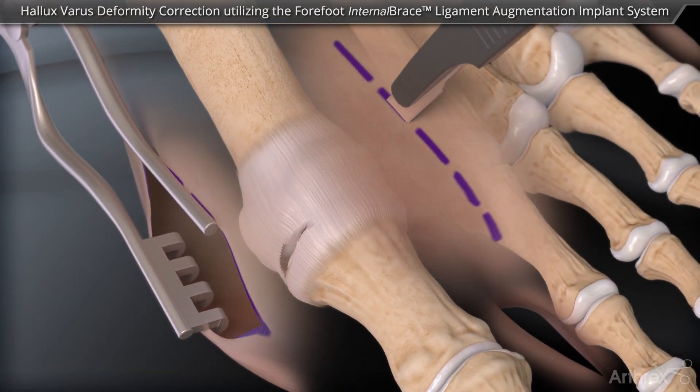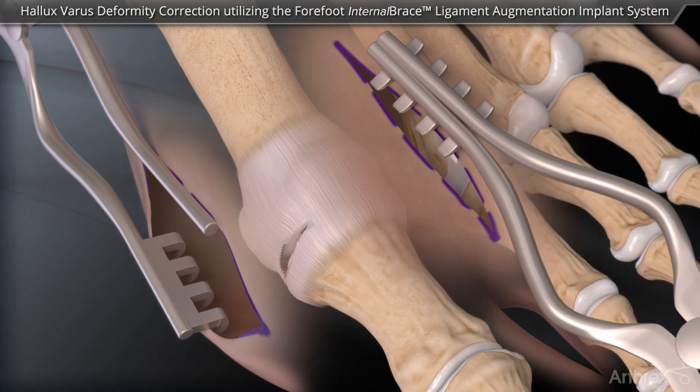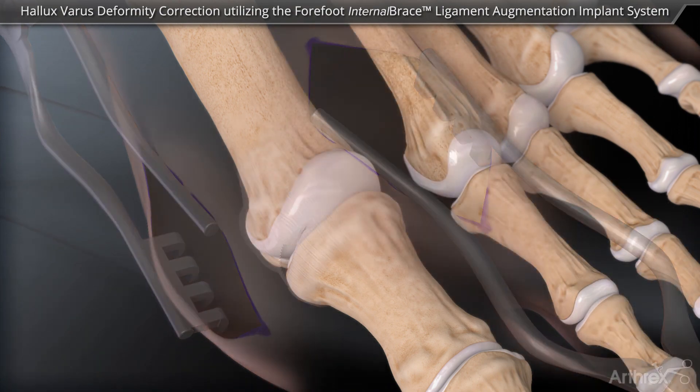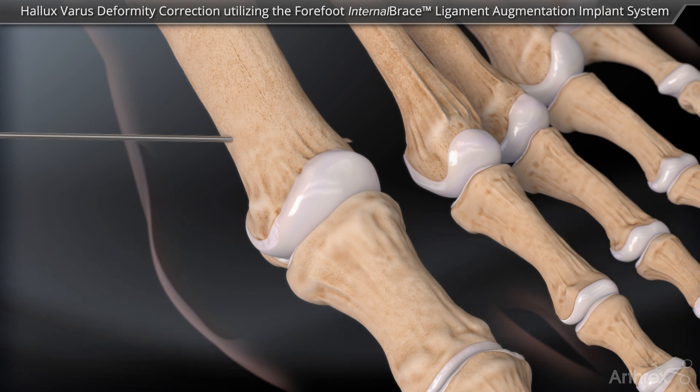A second incision is made in the first web space. A guide wire is placed into the medial metatarsal at the metadiaphyseal junction at midline and is advanced laterally, exiting just proximal to the articular cartilage.